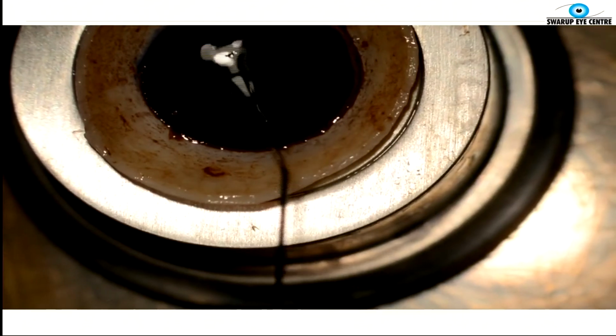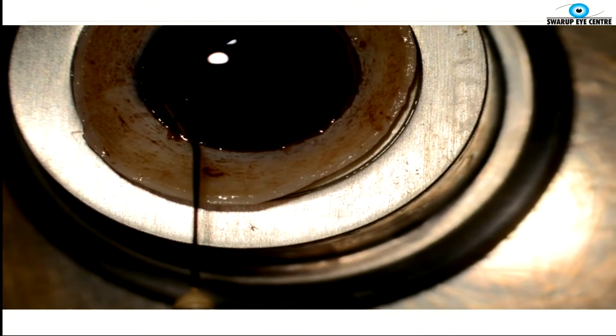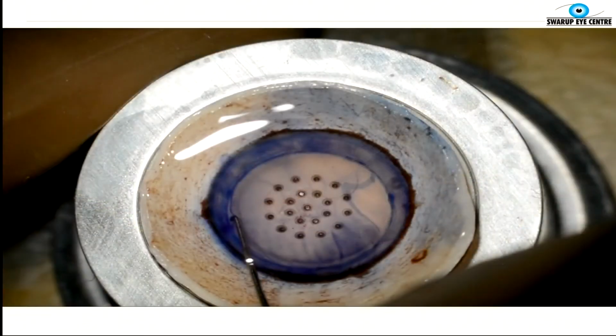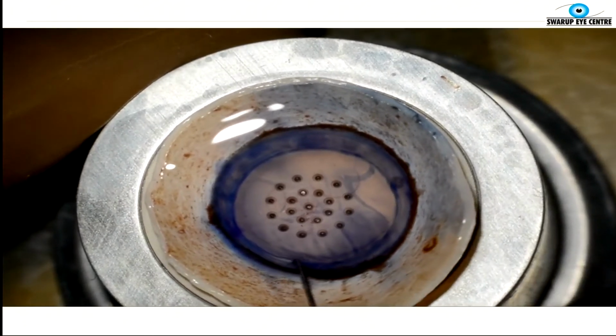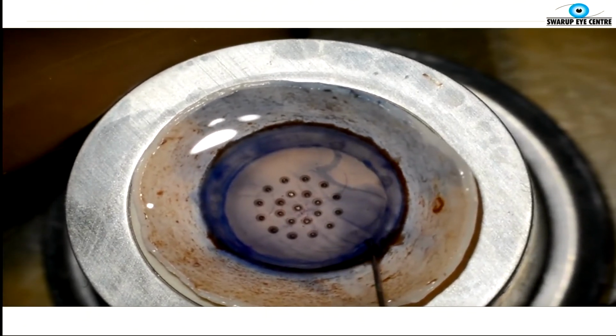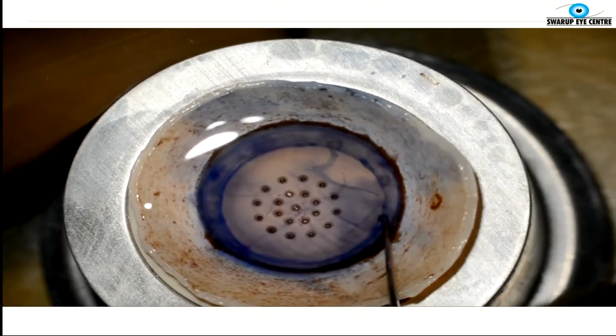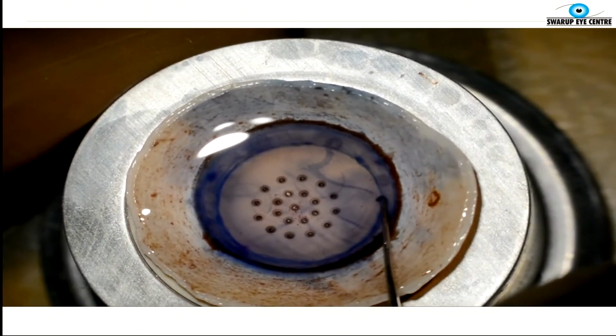It's a good idea to also stain this edge so that you can actually see the cut edge of the Descemet's membrane, and it helps you visualize the Descemet's membrane better. Now you can see the edge, and you can go all around and just lift that edge of the Descemet's membrane with any blunt instrument. In this case I'm using a Sinskey hook. You have specialized Descemet's elevators that are available also if you want to spend money on those.